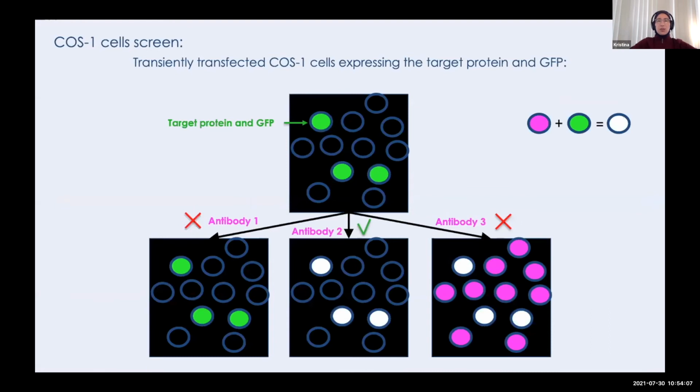Okay, so that's for the resin. We figured out LR White is much easier to test antibodies. What about the actual test? Well, using brain sections, in our case we're interested in synapses, is actually quite complicated because you have such a complicated environment. Some antibodies will be easy, but it's actually quite hard to judge if an antibody works or not. So we need something much more simplified.